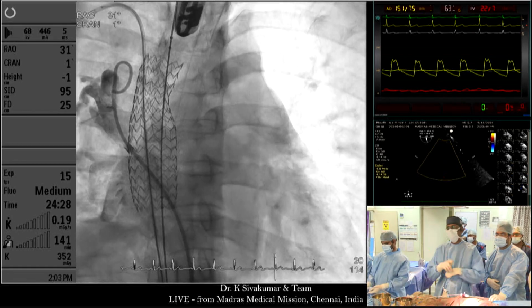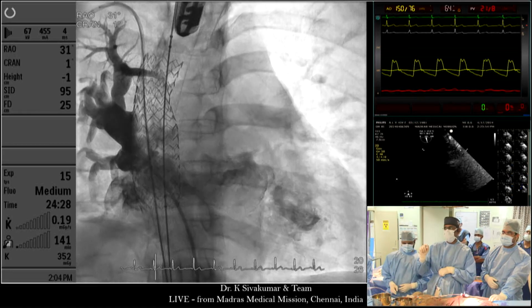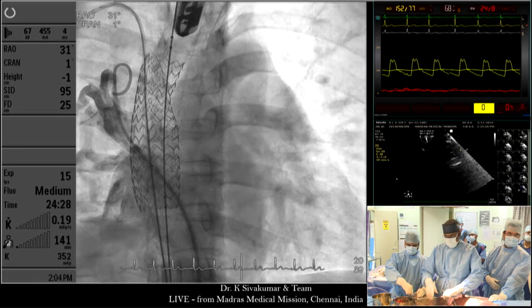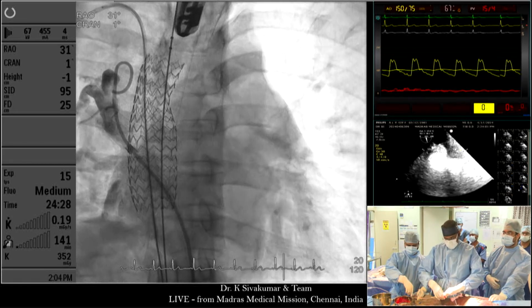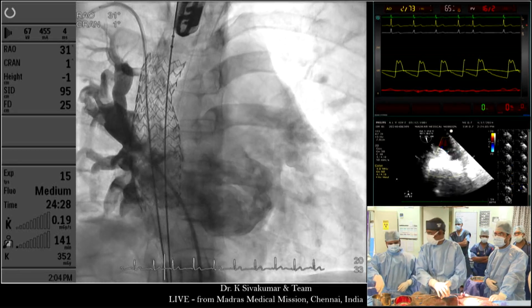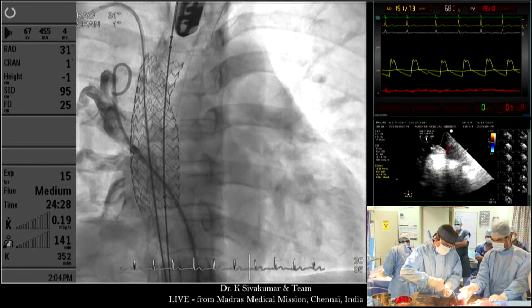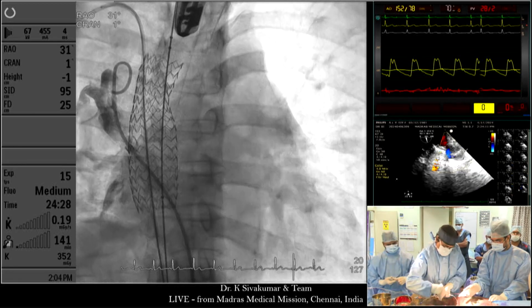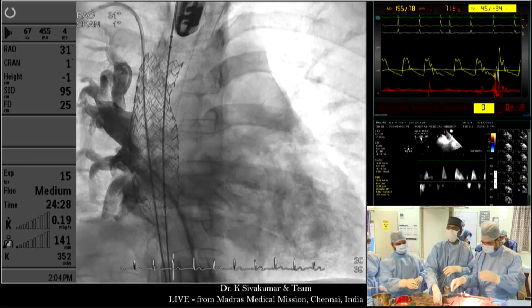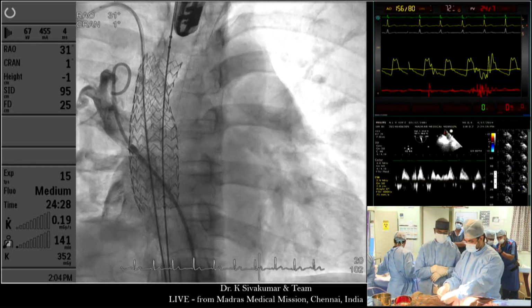We already saw that the pulmonary venous flows on Doppler was laminar with flow reversal. Show the spectral Doppler once again. I'm giving you simultaneous right upper pulmonary vein and left atrial pressure. Can you give me an artery forceps? Just open this one. So this is the right upper pulmonary vein's laminar flow.